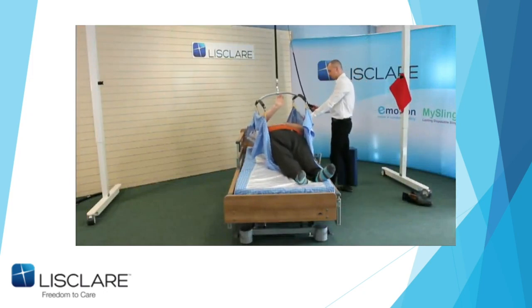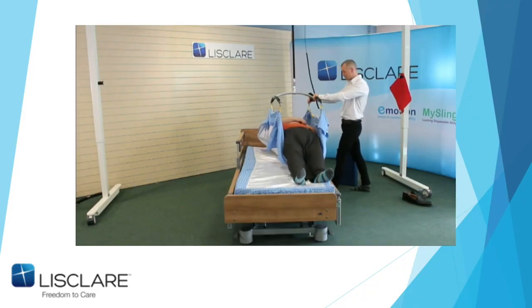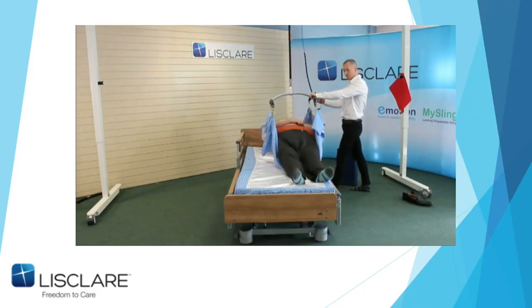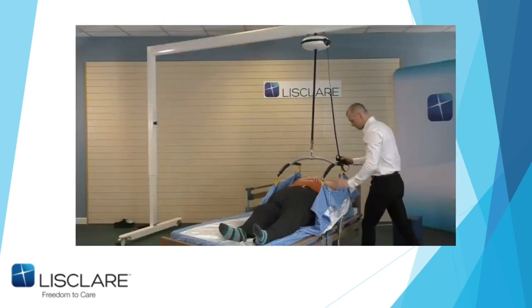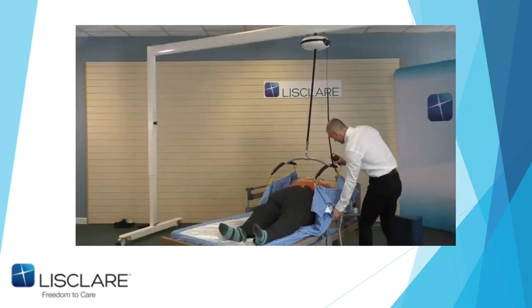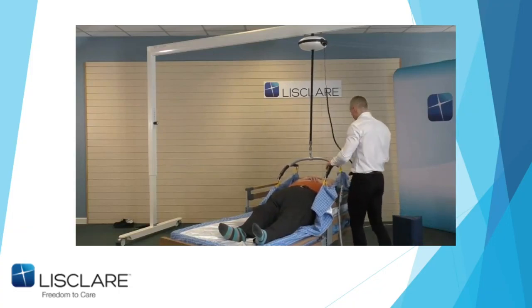That's enough, John. You should be able to just grab the spreader bar, lean in back, and slide me towards the edge of the bed. There you go. Okay? Done. And he lowers it down. At this point, he knows I'm close to the side of the bed, so he'll lift that side rail up. Could have got a wee bit further there, John, but we can show that again if I want.